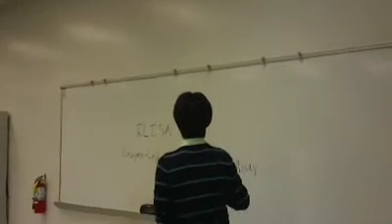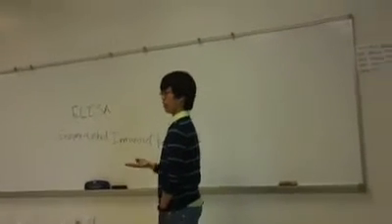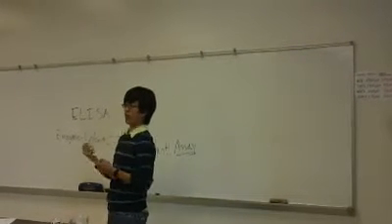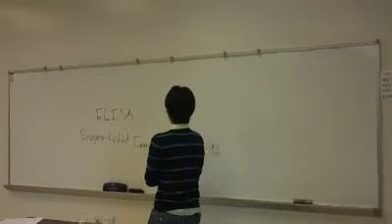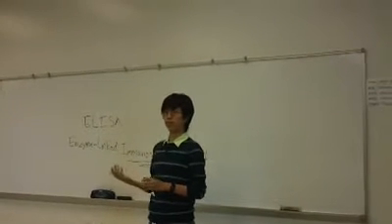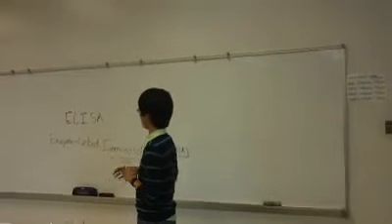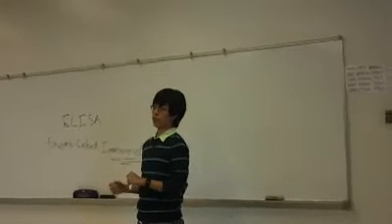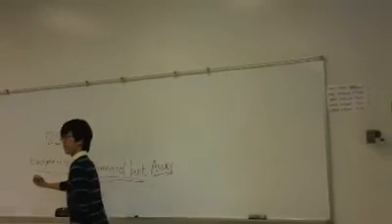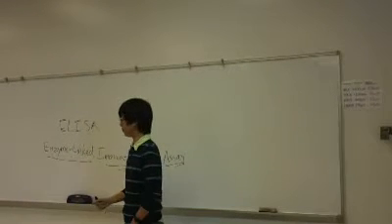All right, so the first thing we're going to be discussing is what an assay is. An assay in a biology lab is just a procedure. It's a set of instructions for how to actually execute something. And then next is immunosorbent. Immunosorbent just means we're going to be using some antibodies to detect if this is going to be working or not. And enzyme linked means we're going to use an enzyme to see if there is actually an HIV-1 antigen present in the blood.